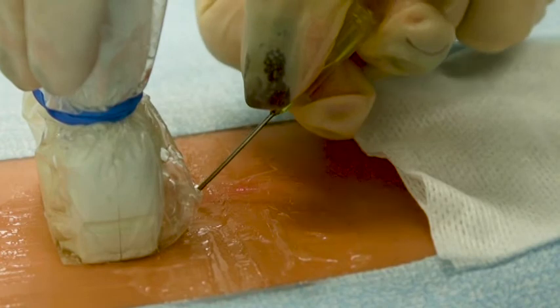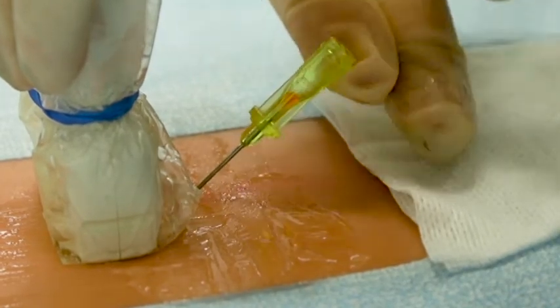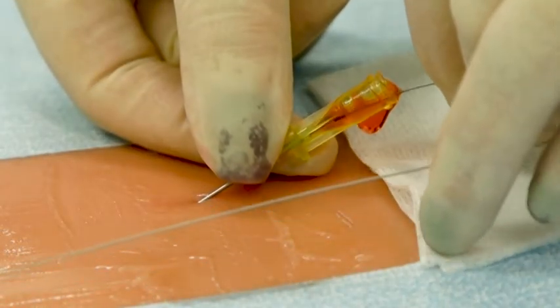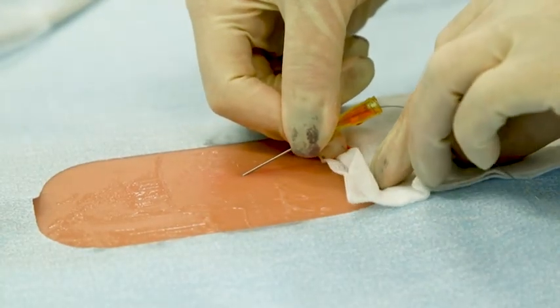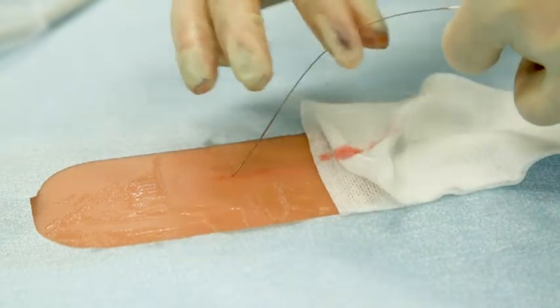Using the ultrasound, identify the artery. Puncture the artery with the introducer needle using a continuous controlled slow forward motion. Once blood flow is visualized, stop. Blood flashback is a successful entry into the artery. Avoid transfixing both walls of the artery. Lower the placement device assembly slightly, then stabilize the position of the introducer needle and carefully advance the placement wire through the needle. The reference marks on the wire indicate that the wire has exited the introducer needle. If resistance is encountered during wire advancement, withdraw the entire unit and attempt a new puncture.